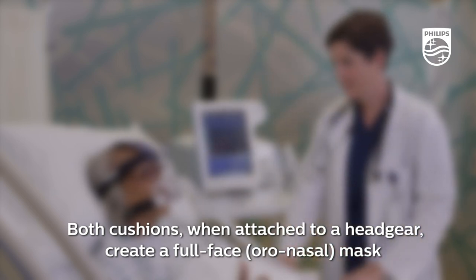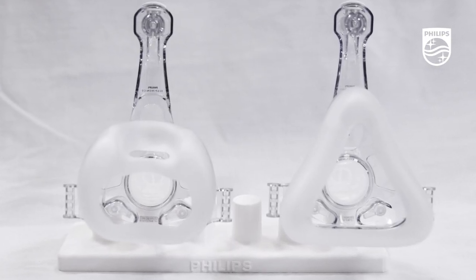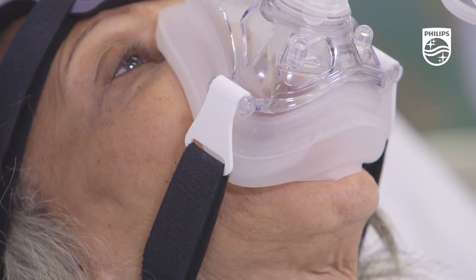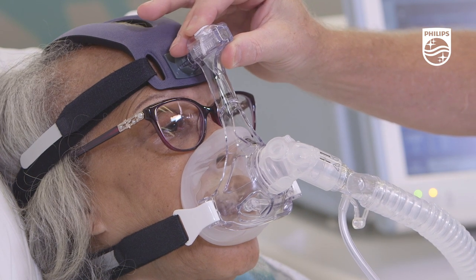The cushions are designed to be self-sealing, which helps minimize over-tightening the mask. The over-the-nose seals are similar to other Philips oro nasal masks, while the under-the-nose seals are similar to a nasal pillow cushion.